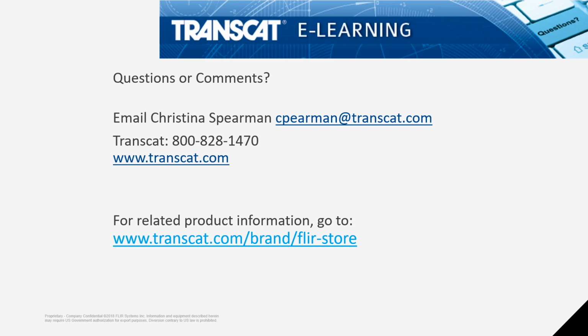But when you're in screening mode, you would have somebody step up, and then you would hit this P button, and it would quickly store that temperature and average it in. Then you'd have the next person walk up, you'd hit that P button, and it'd store that temperature and average it in. So let's say you work in an office building and people come in between 7:30 and 8. You could scan the first 10, 15, 20 people, and once you get a good baseline, a good average, then for the next 100 or 200 people that come through, pending that they're coming through in the next 30 minutes and not coming from a drastically different temperature, or the temperature didn't go from 70 degrees to 90 degrees throughout that time period, you could just use that baseline.